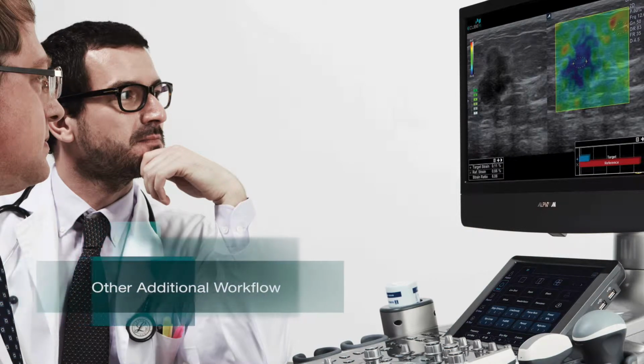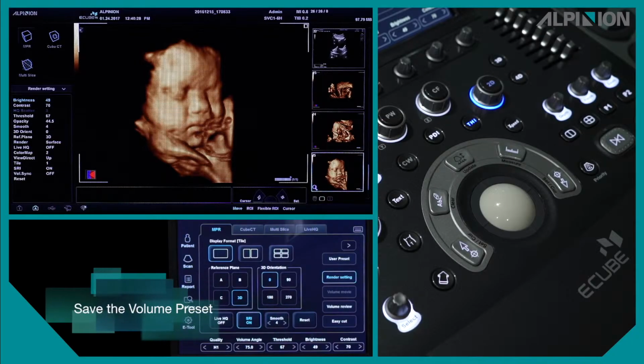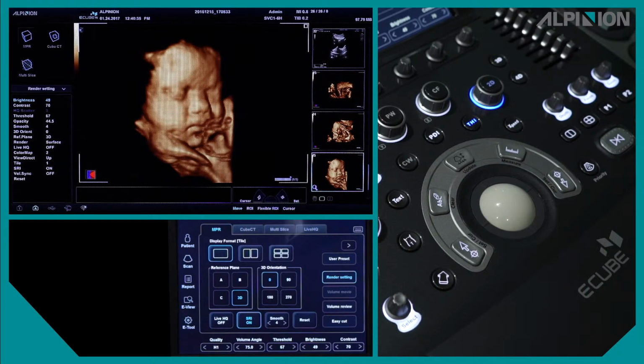Other additional workflow. Save the volume preset. If you found your preferred volume preset after a few adjustments, you can have your own volume preset and bring it out every time you go to the 3D 4D mode. It will reduce your operation time and steps.